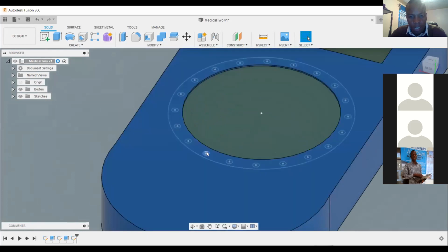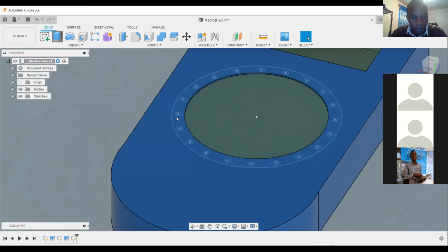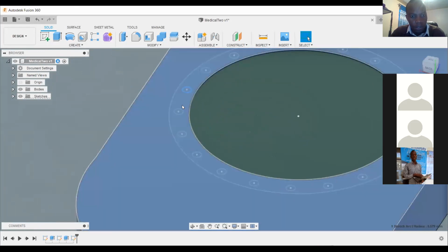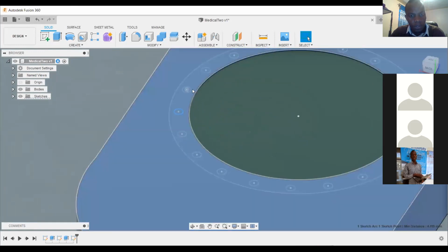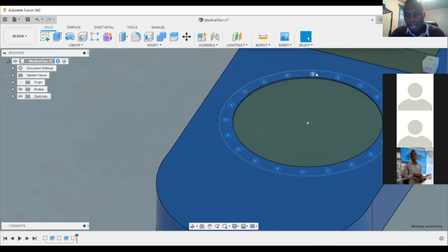When you rotate it, you can decide to extrude all these circles. You can decide to extrude them. Another way is you could have extruded one and then you create the pattern. You get the idea. You click on whatever you want to. So here you are extruding multiple of them. We are making them a bit rough so that you can use it like a knob.